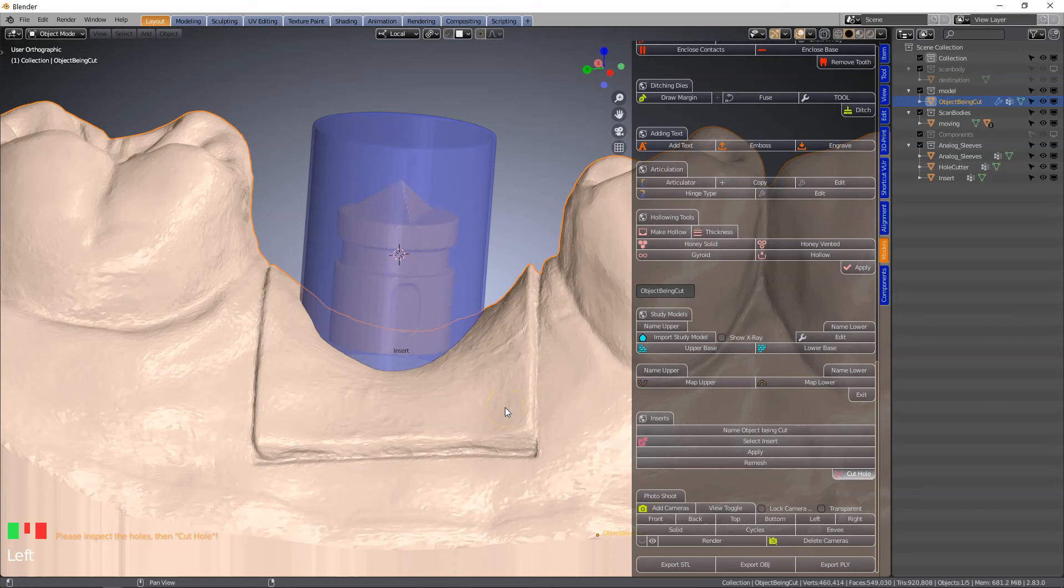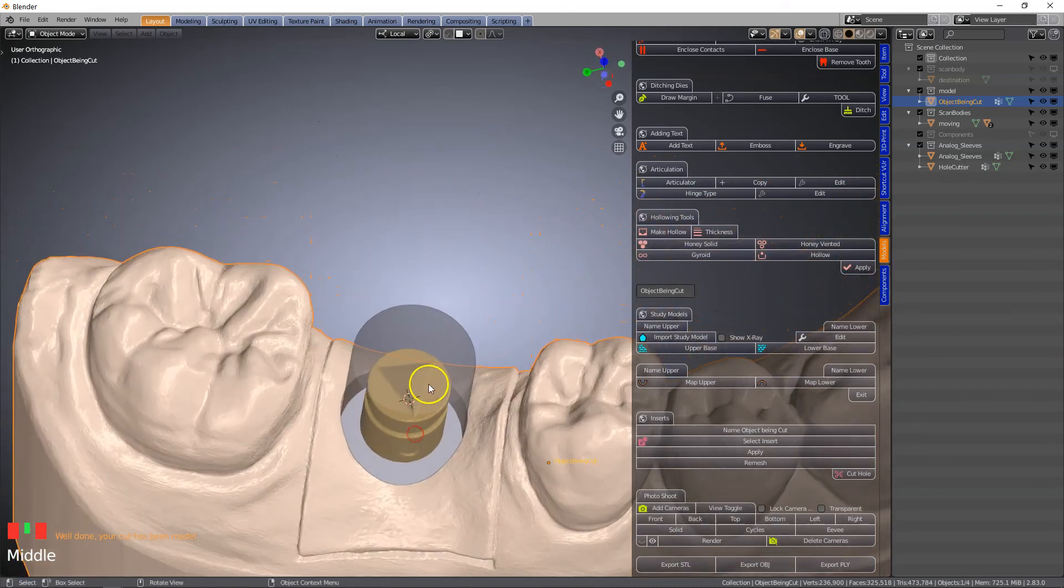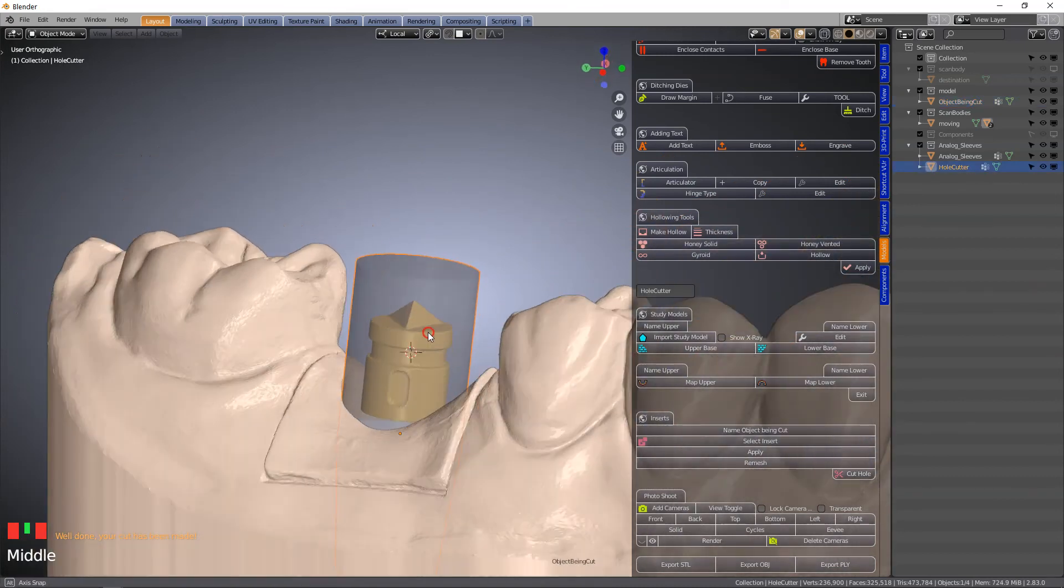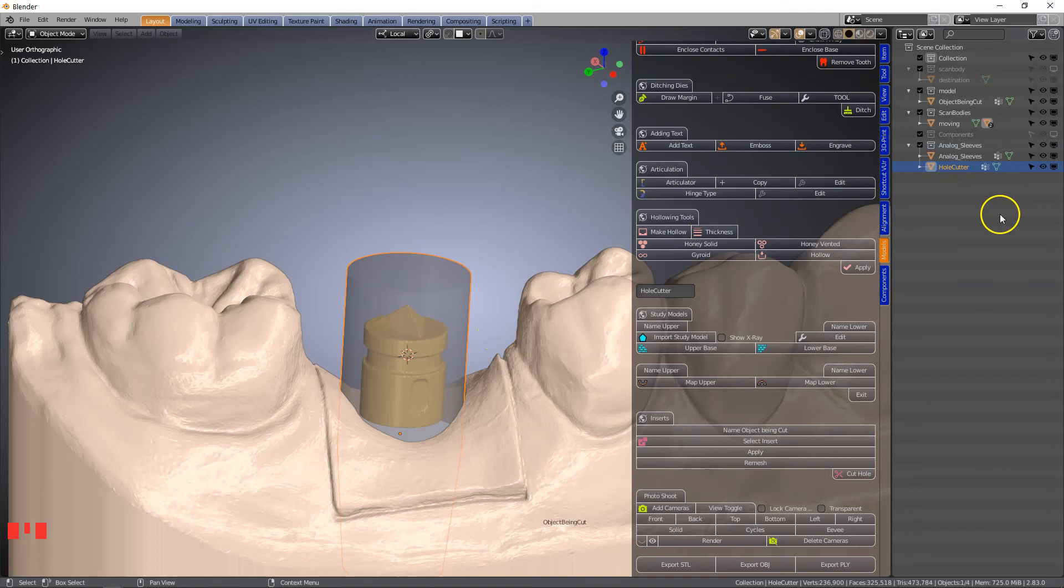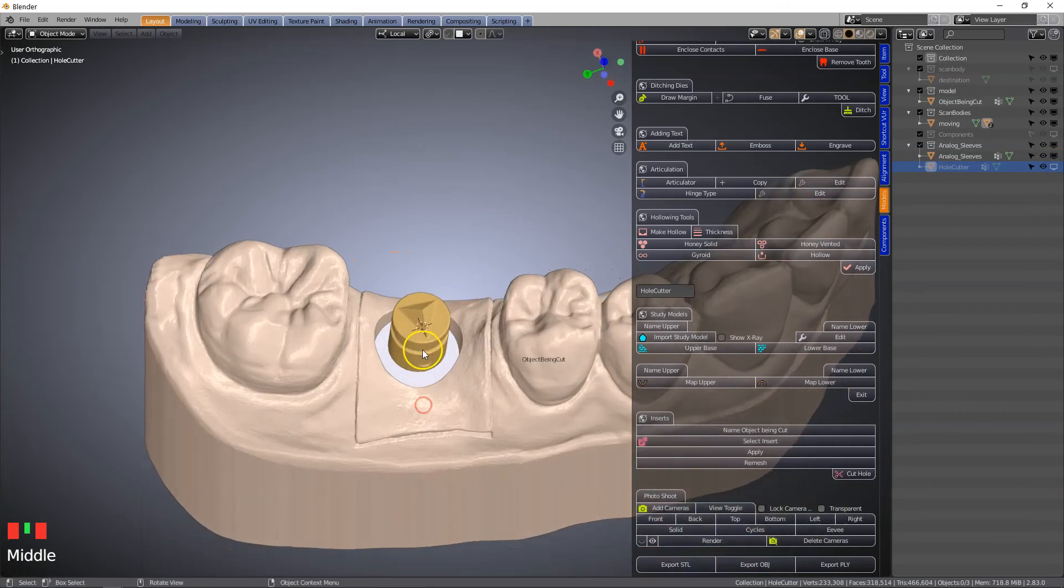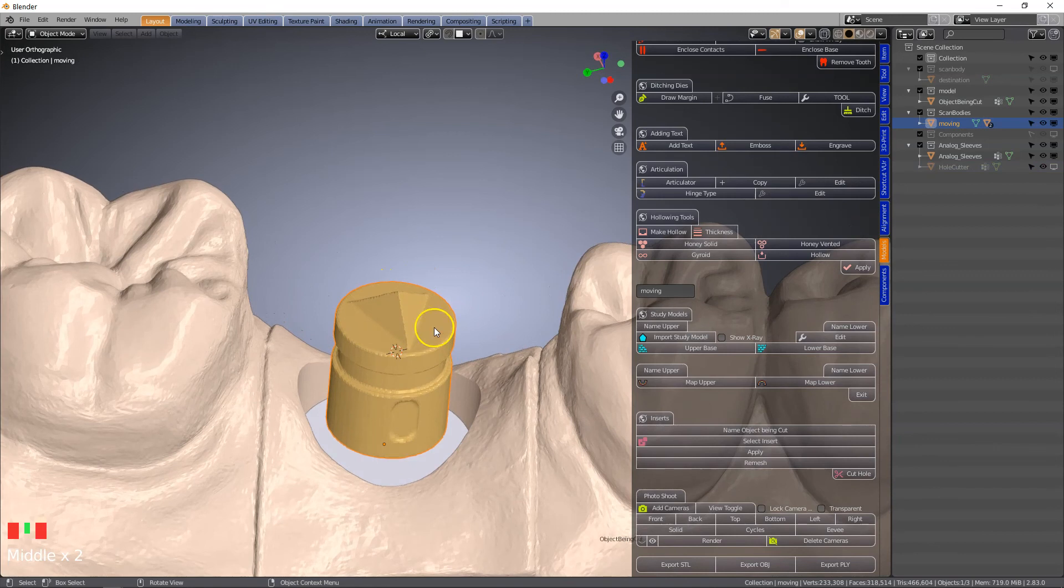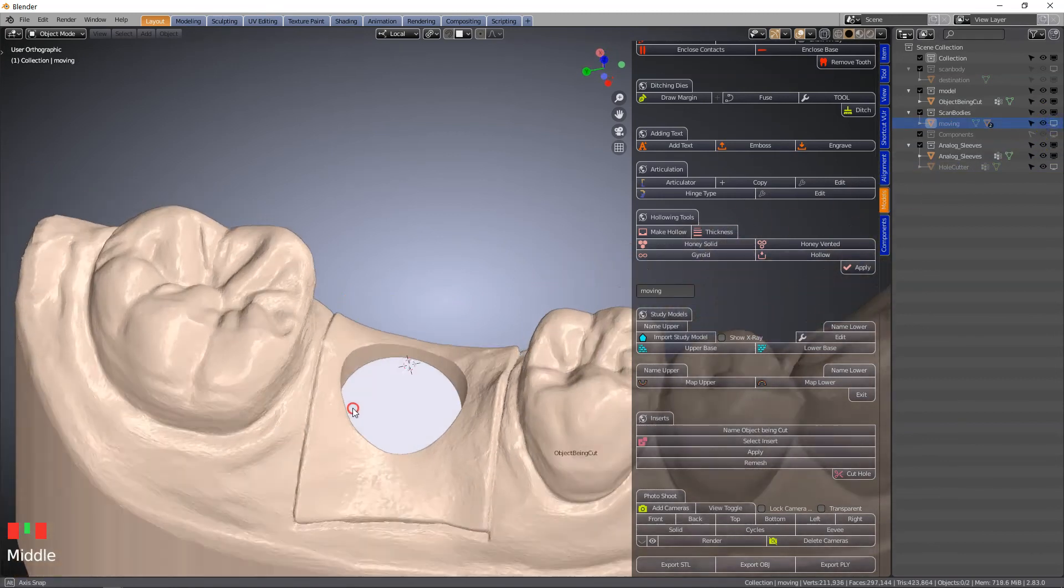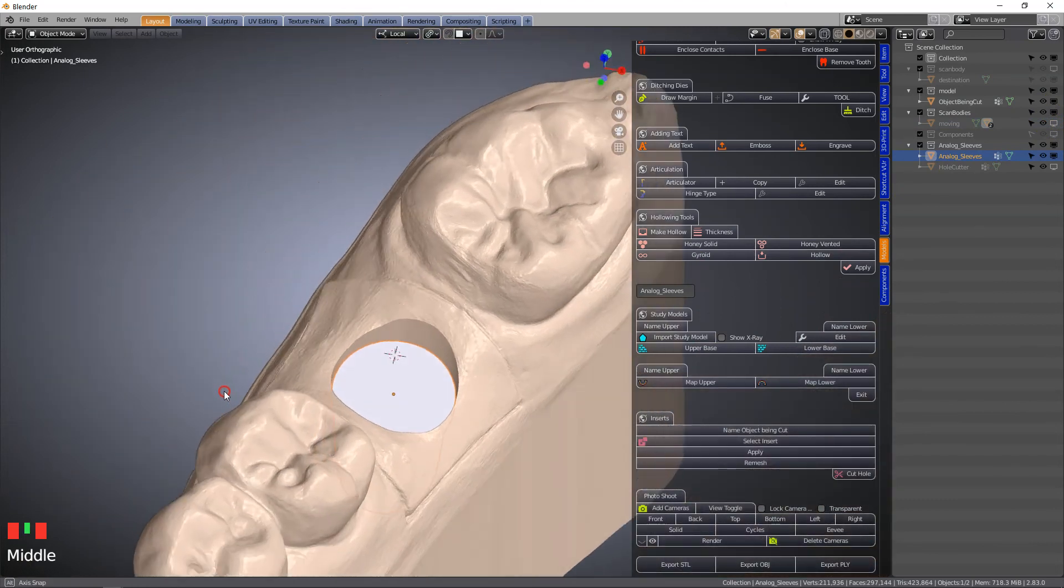This will leave a cavity in the model. Now we have our cutting tool there. We no longer need to see this cutting tool. This is called hole cutter. We can hide this. And our scan body we do not need anymore either. We can hide this. And we've got our analog in position.